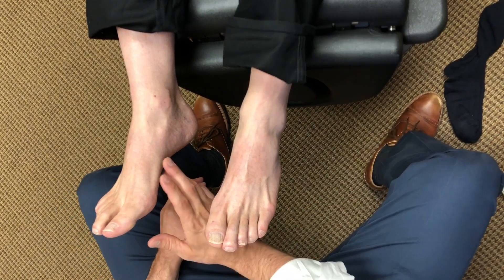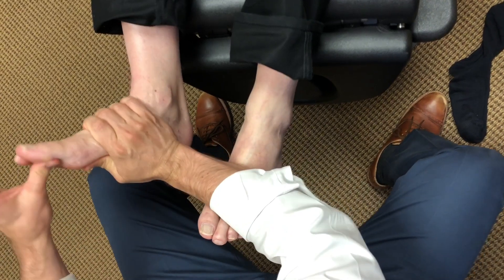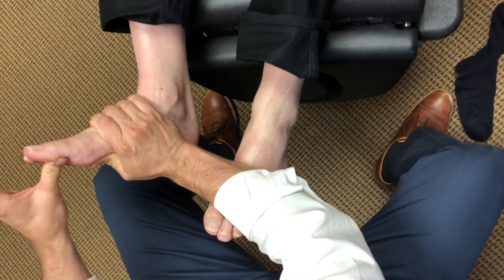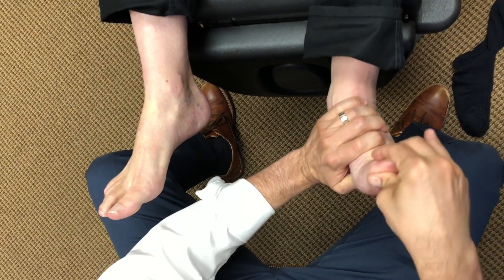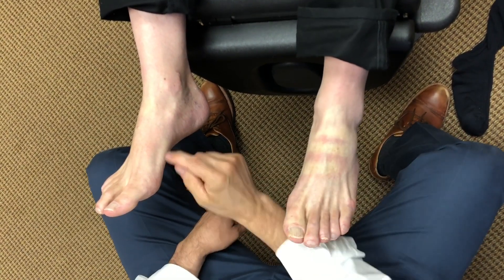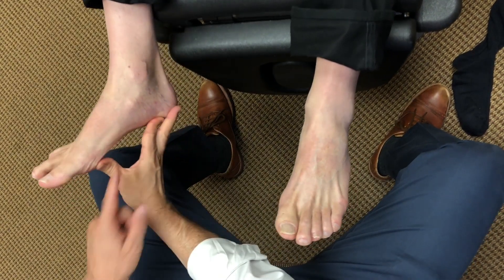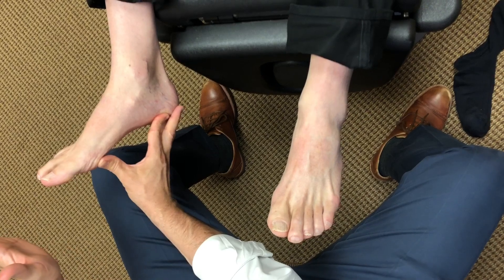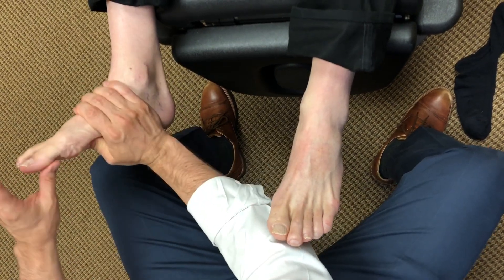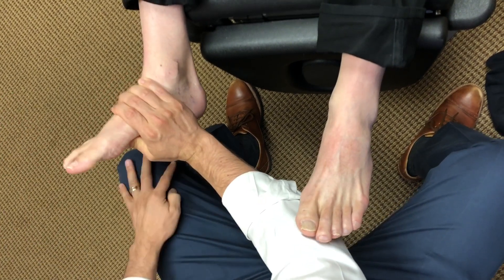Usually what we have with that is a dysfunction in the windlass mechanism. So when we extend that big toe back on the hyperpronating foot, it doesn't go back as far versus this one — when we extend that back, it goes back just fine. That's because the arch is collapsed and the foot is elongated, and that plantar fascia — that tissue underneath — is maximally stretched. It doesn't have any more give or slack in that tissue, so when we ask it to go back into extension, it doesn't go anywhere.